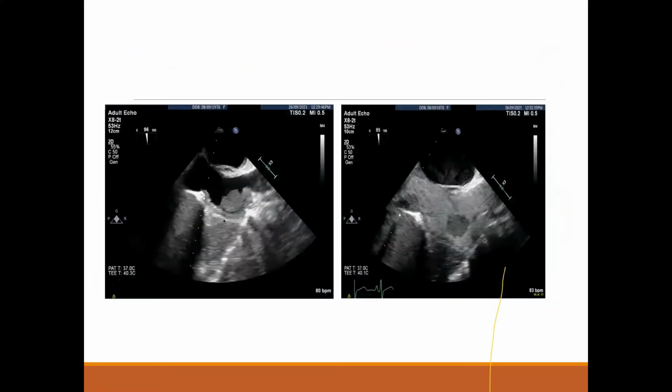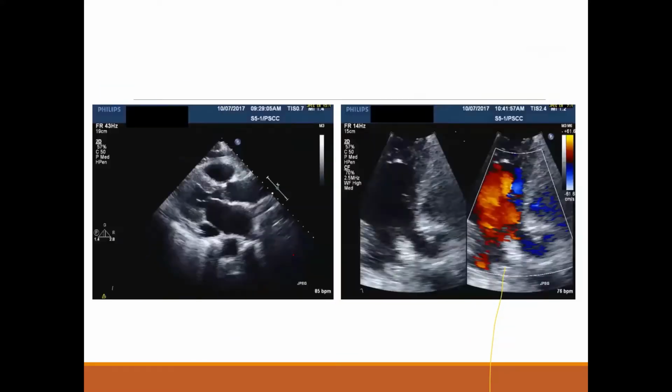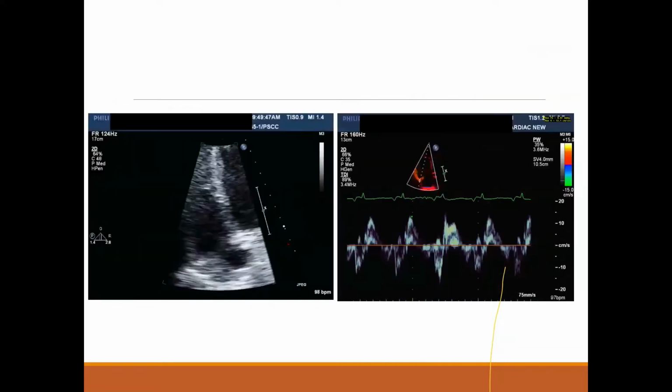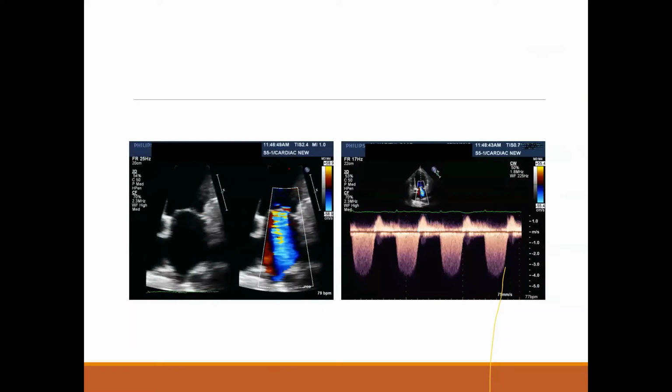Okay. We must go back. Now, what are we seeing here? So, what do you see?